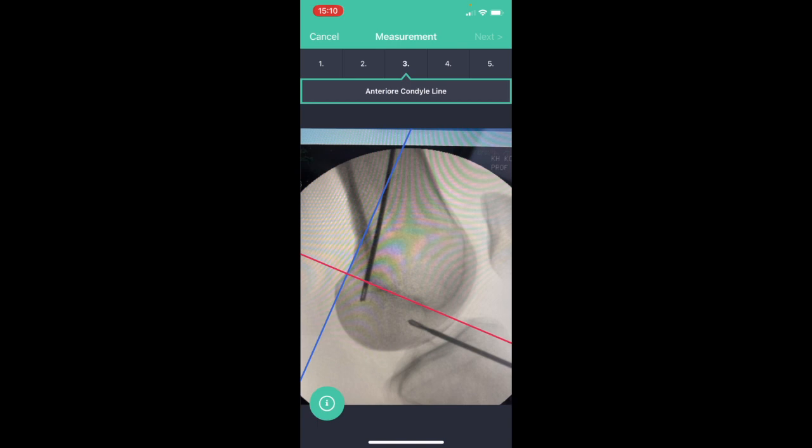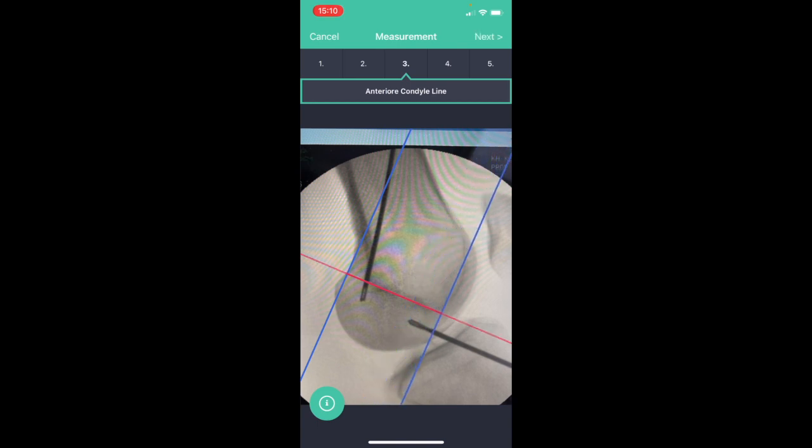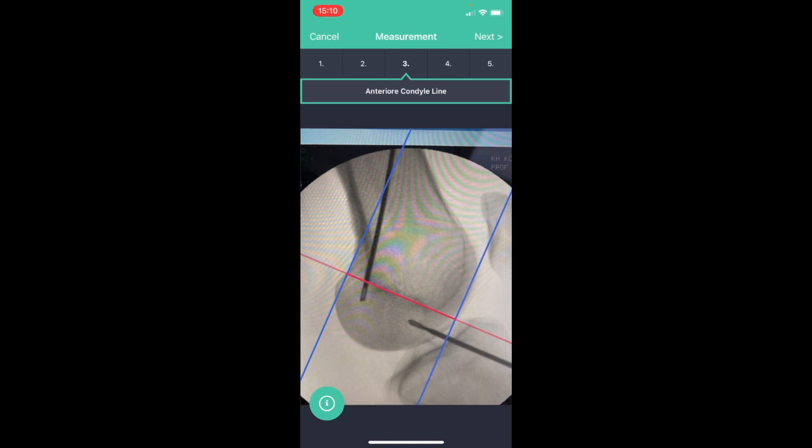I move to the next step. I establish a third line, another blue line, perpendicular to the red line and establish the anterior condyle line.